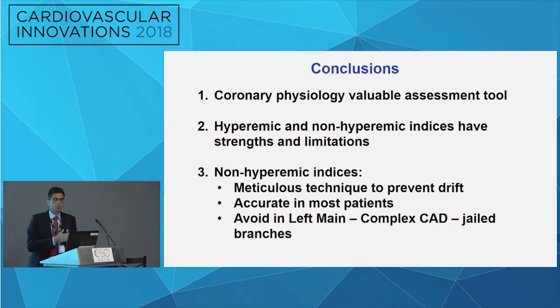The question is, if it's abnormal, is it abnormal because of the anemia increasing the resting flow, or is it because of the lesion? That's the one area. Maybe, and I'm just thinking, I don't know for sure, but by giving adenosine you can see how much more you can increase flow, and doing a real adenosine FFR may be the more accurate way to go. That's a great question, actually. Maybe that's a good thing for a study.